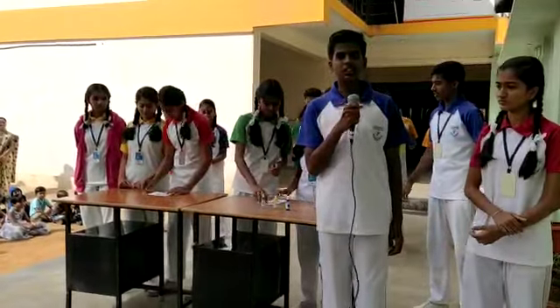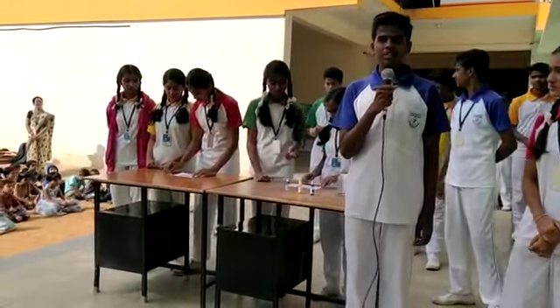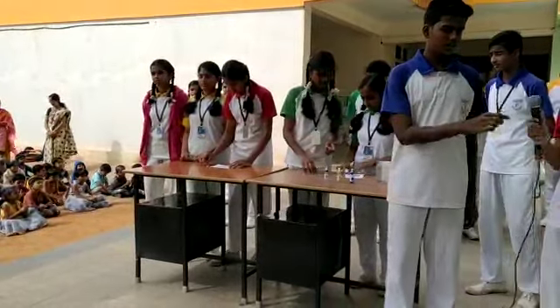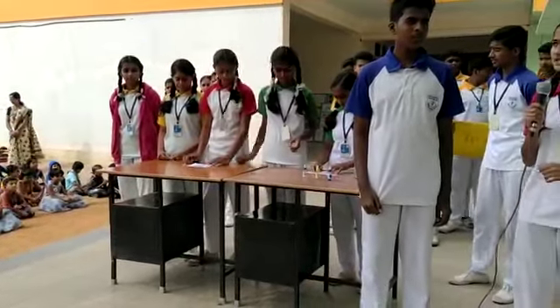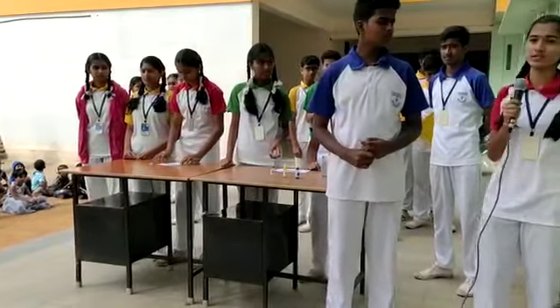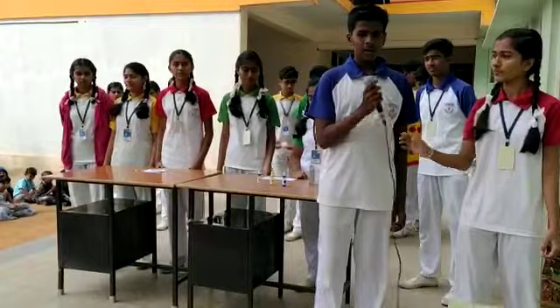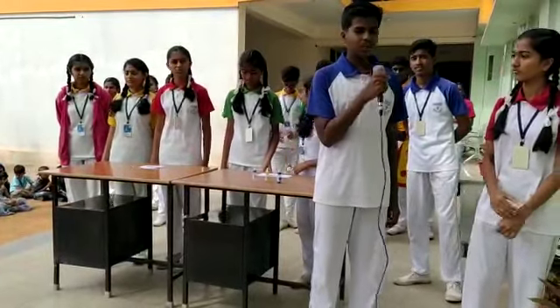Blood is a fluid connective tissue which supplies nutrients and respiratory gases and carries waste materials to the kidneys. There are 4 types of blood: A positive and negative, B positive and negative, AB positive and negative, and O positive and negative. This test is called ABO typing.